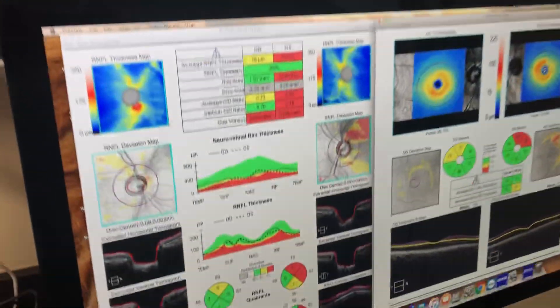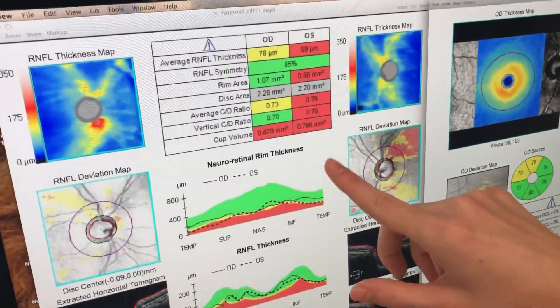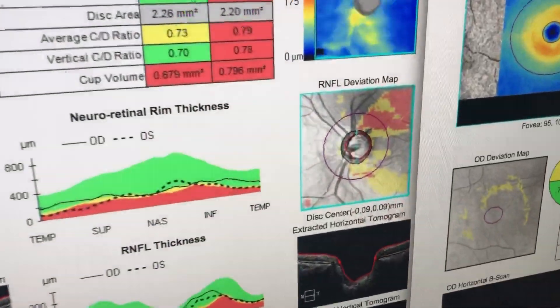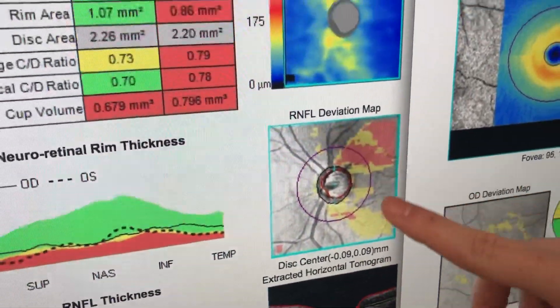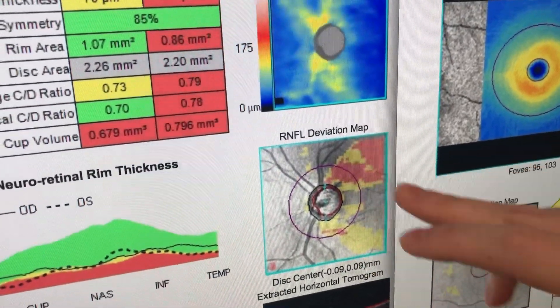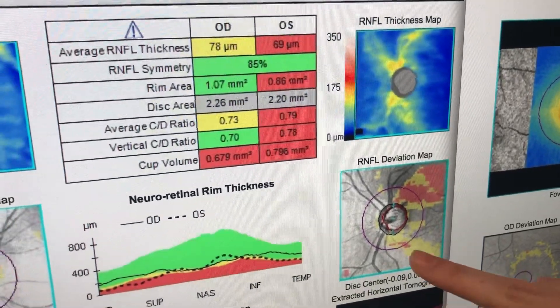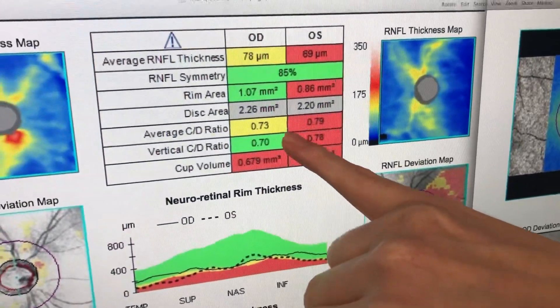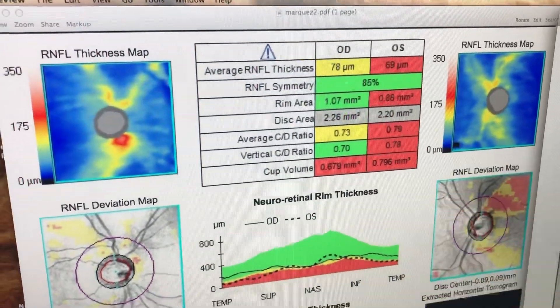Hello, today we're going to be looking at the optic nerve and retinal nerve fiber layer analysis on a Zeiss OCT. The optic nerve is the cord that connects the brain to the eyeball, and we're looking at all the wiring feeding into that cord. We're comparing this to the normative database to see if there's any thinning of those areas. As you can see, this patient has a large cup-to-disc ratio, but his nerves are also very large.